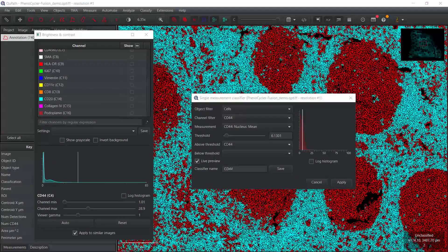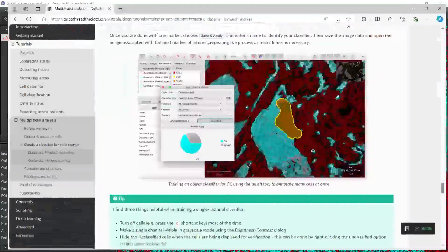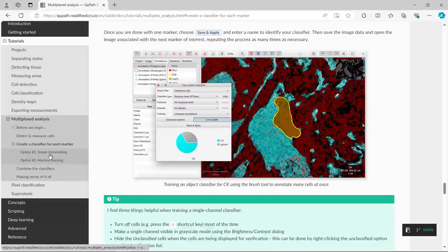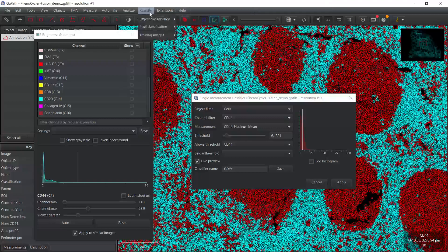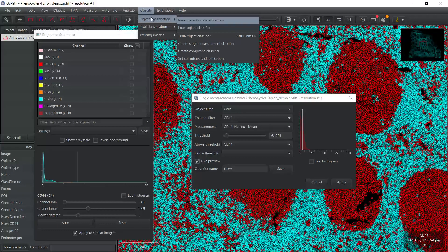So let's have a look at the online tutorial again. You can see here, after you created a classifier for each marker, the next step is to combine the classifiers. We can click and have a look. You can see we can go to Classify again, Object Classification, then Load Object Classifier. So let's do it. We can go to QuPath, Classify, Object Classification, then Load Classifier.